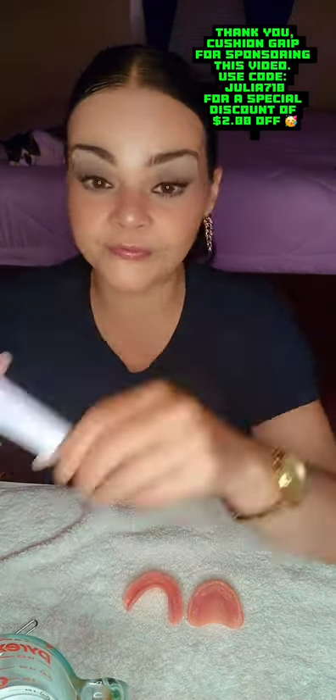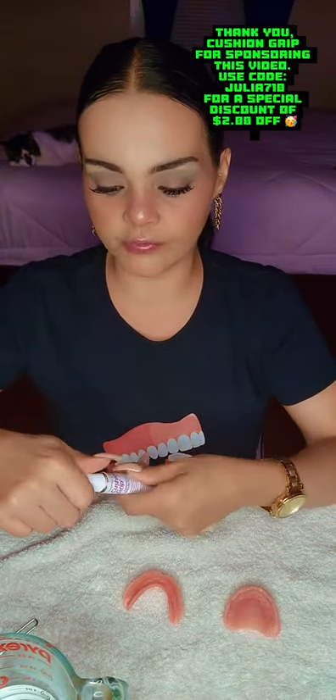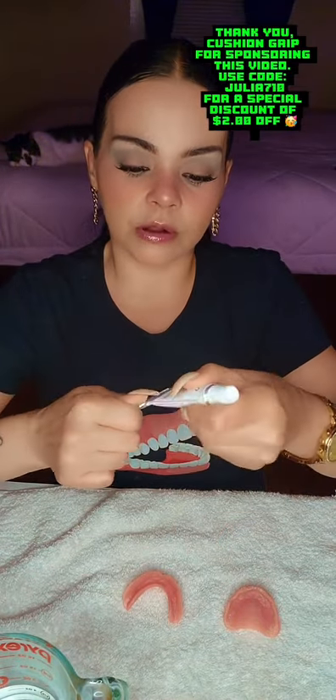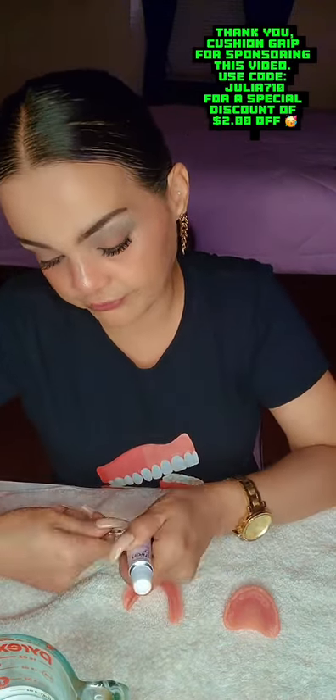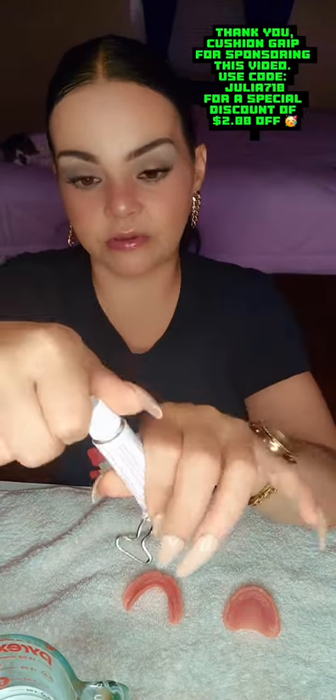Moving along with the video — now it's nice and warm, I'm going to apply it on my denture. We're going to use the little key. Make sure this key is warm, because it will help you push up the product. Sometimes it can get a little hard. So just make sure it's nice and warm. You want to add your key, and this is what you got to do — just rip it, uncap it.